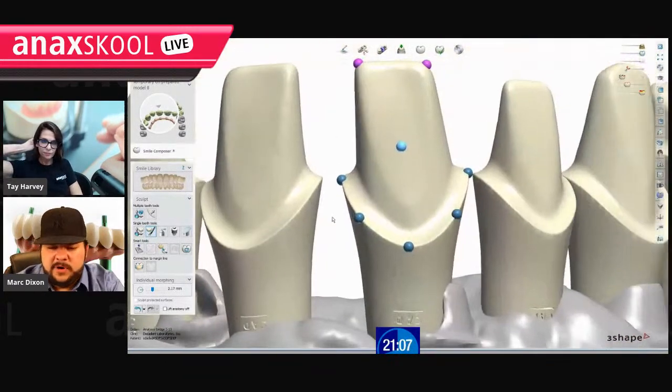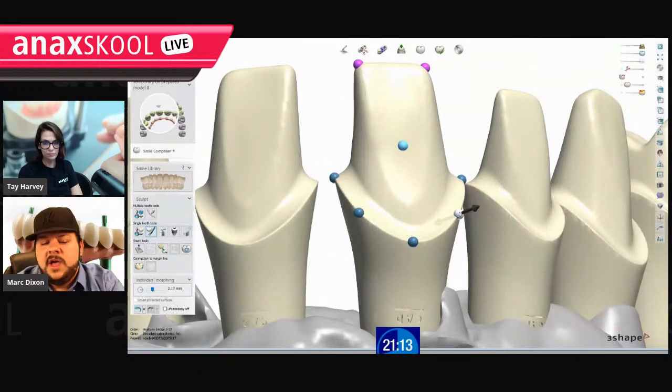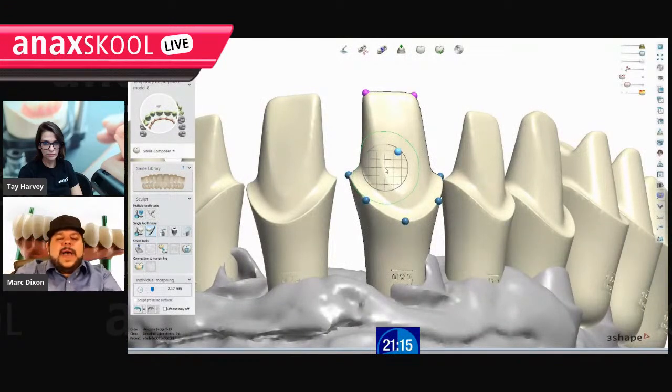Well, you could do it before with this tool, but now that we have points, we get to visualize that symmetry a little bit more and get things right where we want them. I guess it depends on your plan. Do you want your crowns locked in to your gingiva composites? Do you want your crowns to be not locked in, in case something's an issue, so they can just be removed and replaced? Because in a case like that, you'd probably build the gingiva before you finish your crowns.